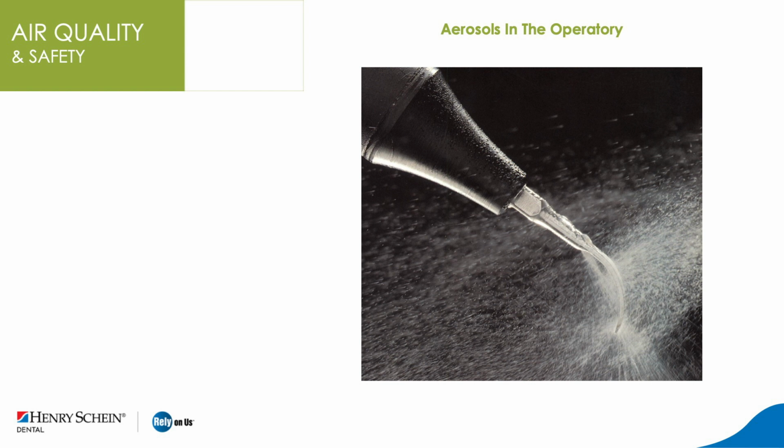So here's the challenge. Aerosols that we must use in the treatment of almost all patients. And, of course, we all have localized methods of aerosol management with intraoral, high-speed and low-speed suction. But this program is going to focus on what we can do to manage the significant aerosol cloud that escapes that evacuation effort.